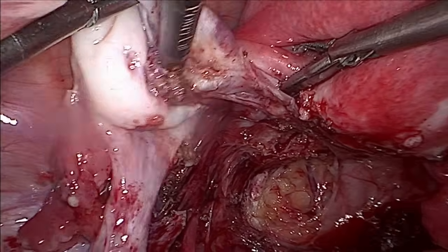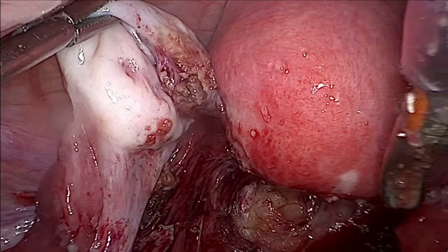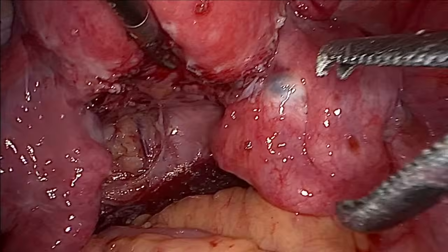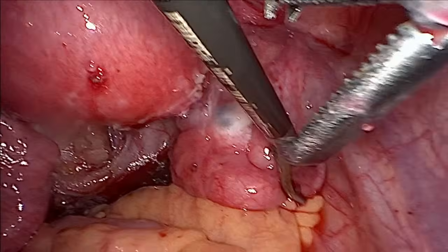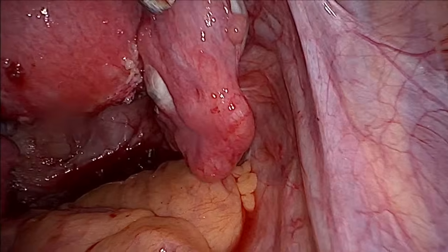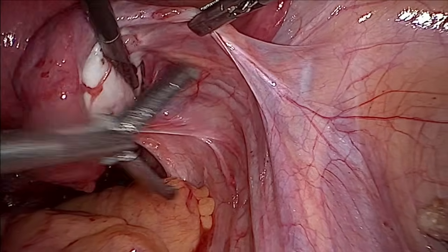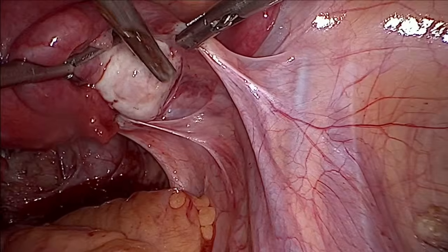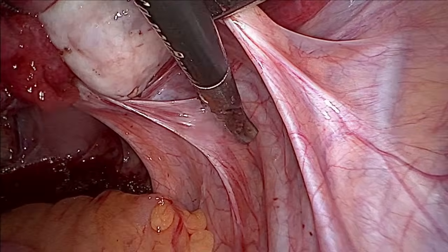Okay, we will leave the cystectomy for the later part. Release. Okay, so now it has been done from one side. Okay, now we'll come to the right side here. Let's see. Yeah, so here you can see that the ureter is going like this.